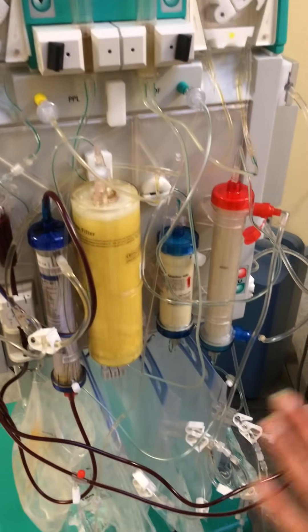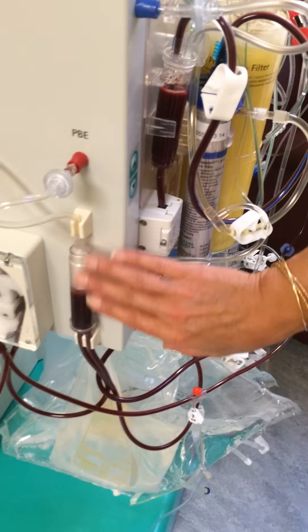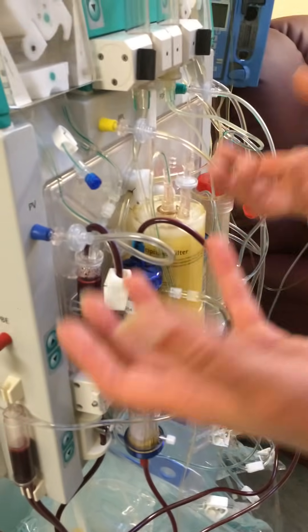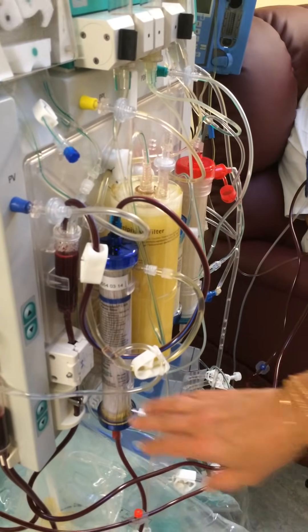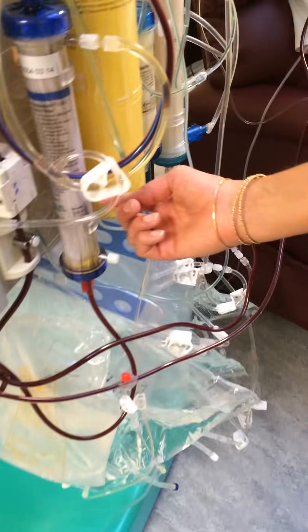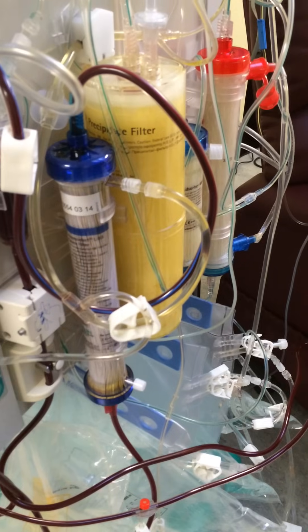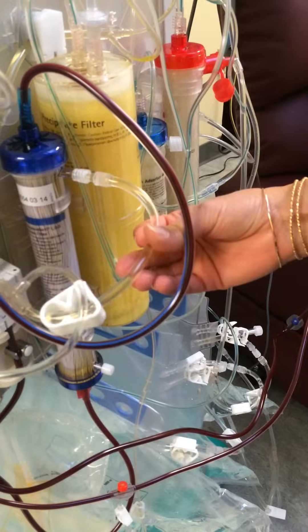Here's how it works. When we start, we circulate the patient's blood to the blood pump and the blood chamber, which is just a holding chamber releasing air. There are several chambers that collect air so you never have to worry about air embolisms, with a safety feature at the end as well. Blood then circulates into the plasma filter, which separates the red blood cells from the plasma, because it's the plasma that we treat.